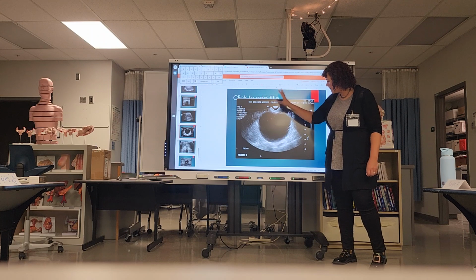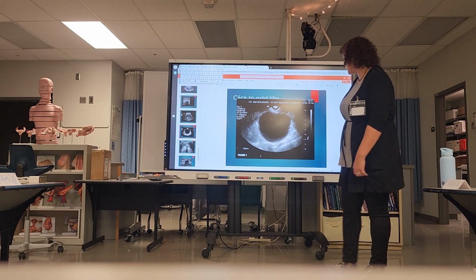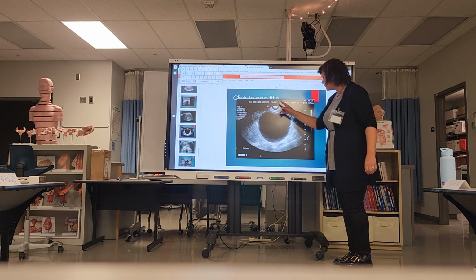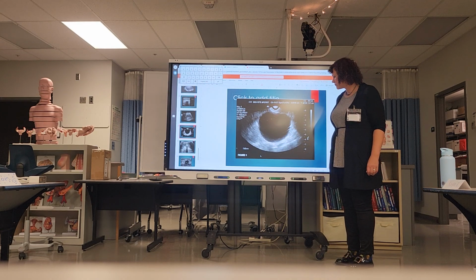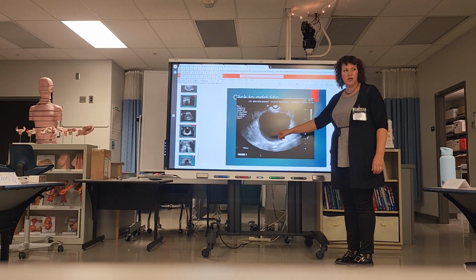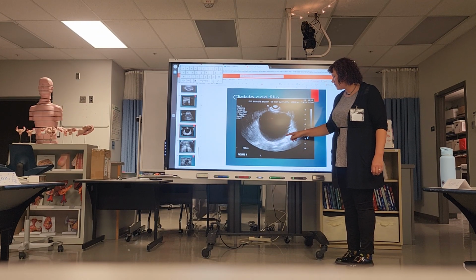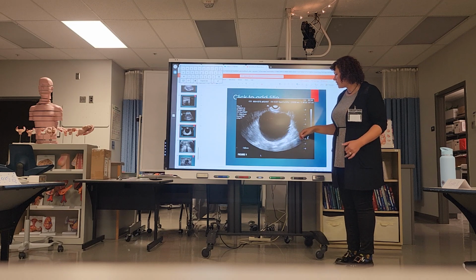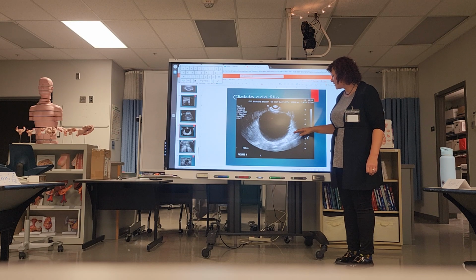It is a very large... I don't even know what this is. If it's a cyst, I think this is an ovarian cyst. What about the bottom part? There's a little bit of discoloration right here. Yeah, this is artifact. So sometimes you will get debris that settles posteriorly, but also you'll have this kind of artifact.